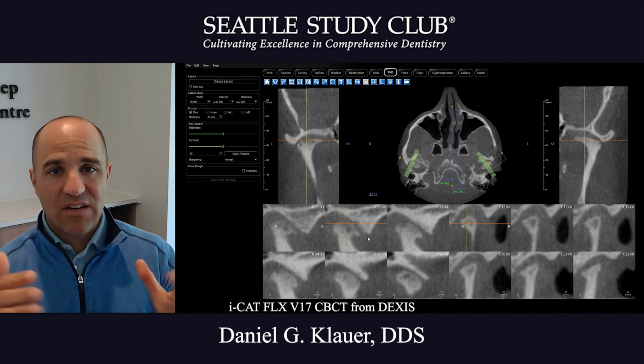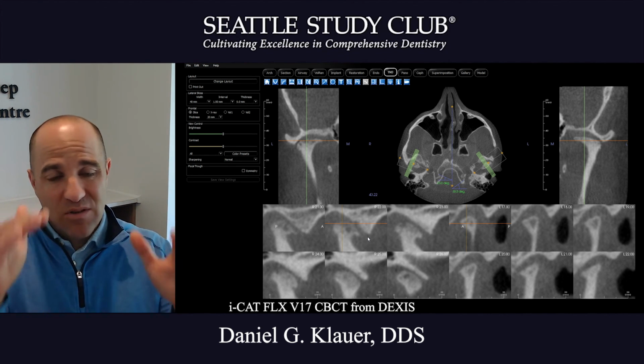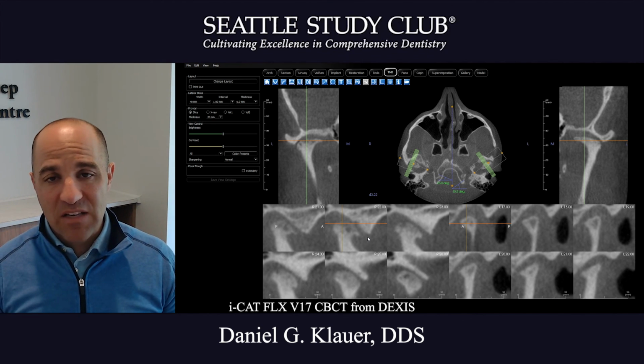It was great to sit down and study those. I usually kept them, so I had about 10 to 20, and then I would just go through 10 or 20 scans at a time, make some notes, and I think that's the best way to learn how to read these things.